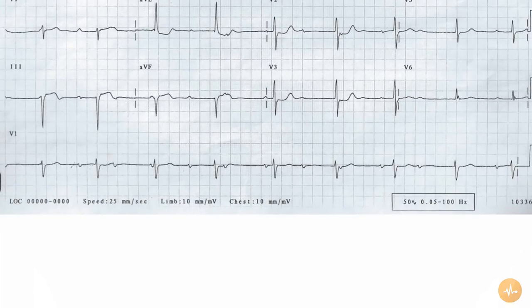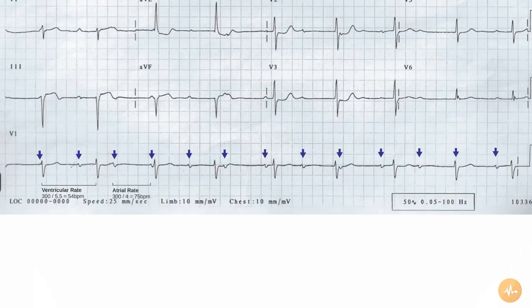The rate is 54 beats per minute. There are P waves present with a rate of 75 beats per minute, but these bear no relationship to the QRS complexes, and therefore the rhythm is complete heart block. The P waves are seen to march through the QRS complexes, as can be seen on complexes 6 and 8, where there is a P wave superimposed upon the QRS.